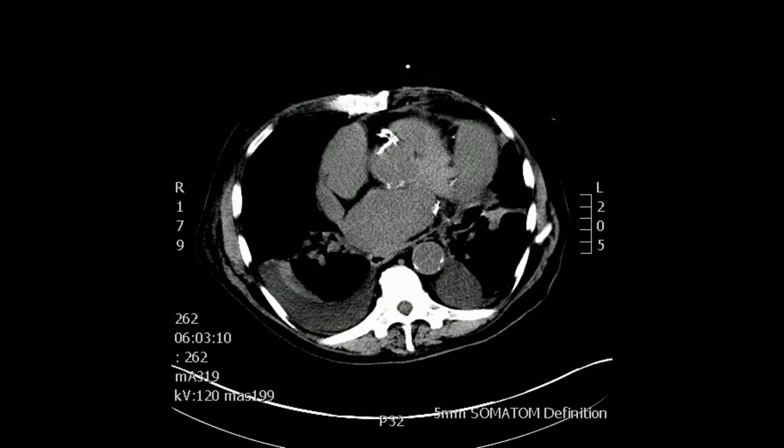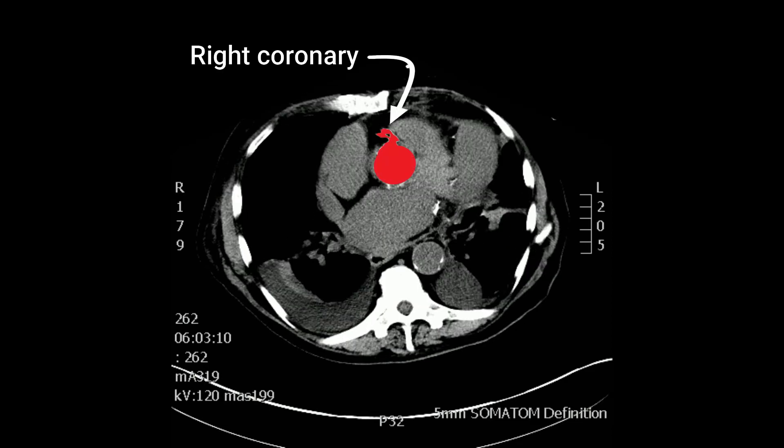And then the right coronary artery, also heavily calcified, as seen in the image.